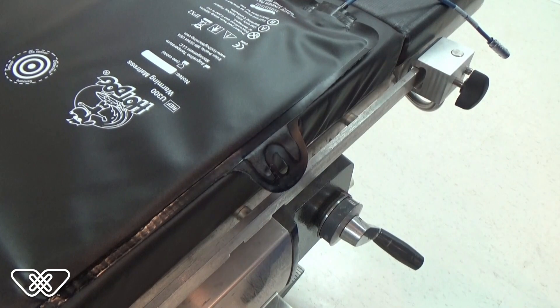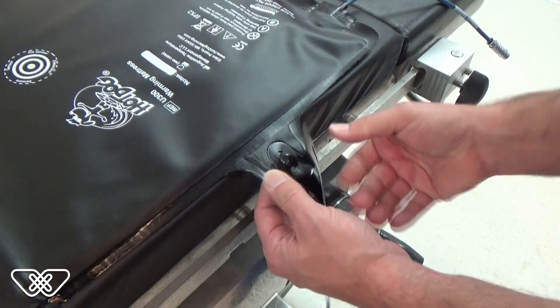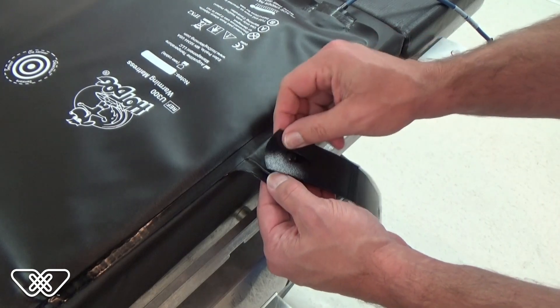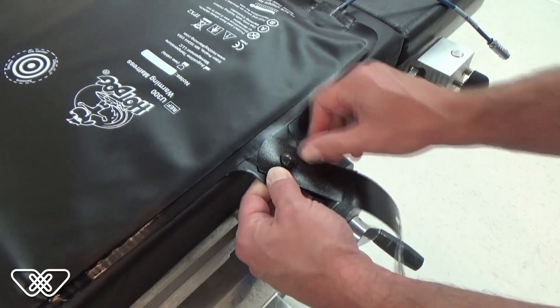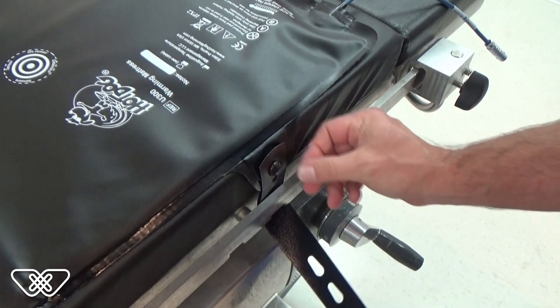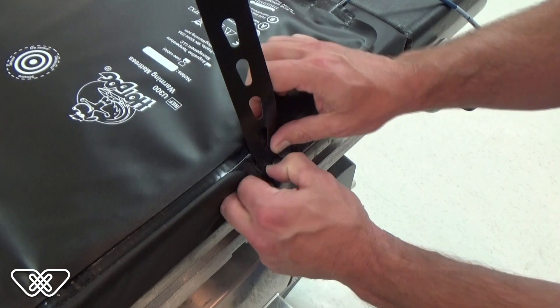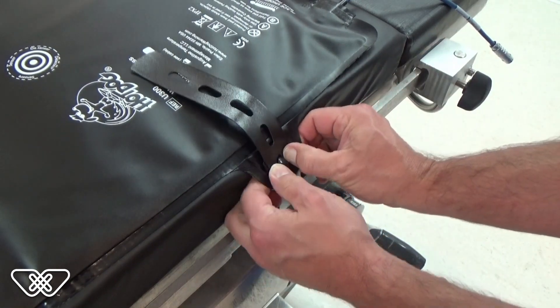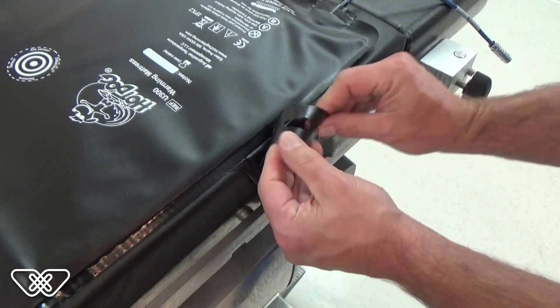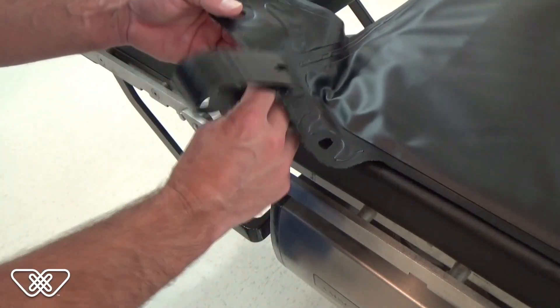To attach a strap to the mattress, separate the end flap from the mushroom button on the strap. Insert the strap's mushroom button through the mattress overlay loop and secure the flap over the mushroom button. To secure the mattress to the OR table, thread the strap through the side rail and fold back over. Then secure it to the same mushroom button. Ensure that the straps are pulled taut before securing to the mushroom button.